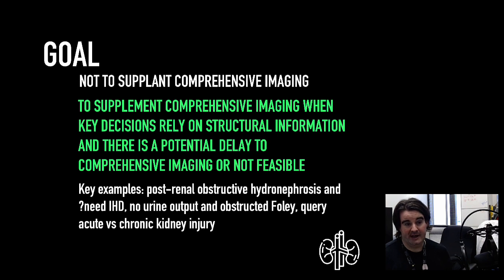Our goal is not to supplant comprehensive diagnostic imaging, but really to supplement it and to help guide or expedite that kind of imaging, especially when that kind of imaging can be delayed or lead to significant decision making with respect to renal replacement therapy or further supports.